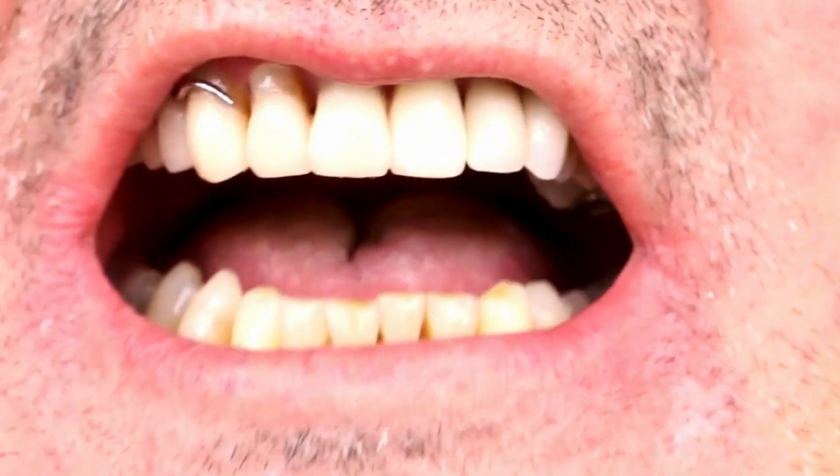And if you have a denture that's not custom made for your specific face and your specific bite, a lot of times you can have either something that's too small so you can't even tell you have teeth in there, or something that's too big and it's almost like you have an apple in your mouth and you're just wide open. In those situations, even when you try to talk and smile, the teeth can clack against each other. It's unsightly and it's very frustrating.